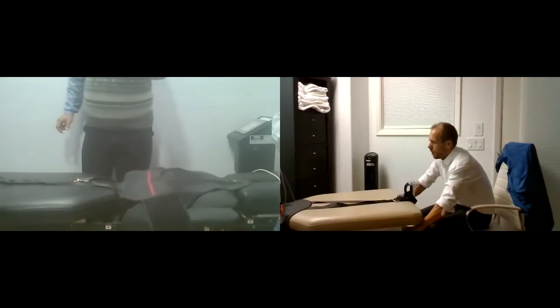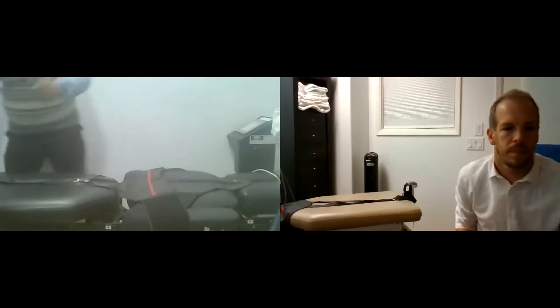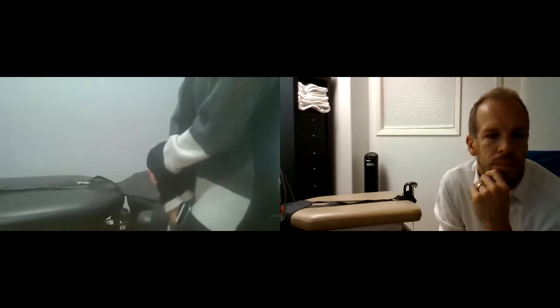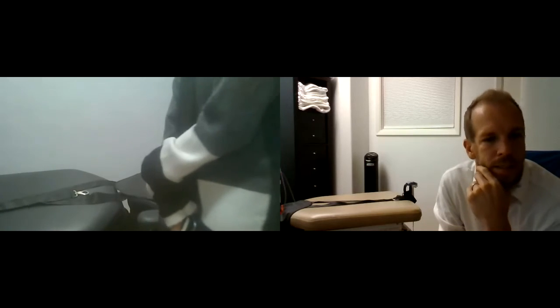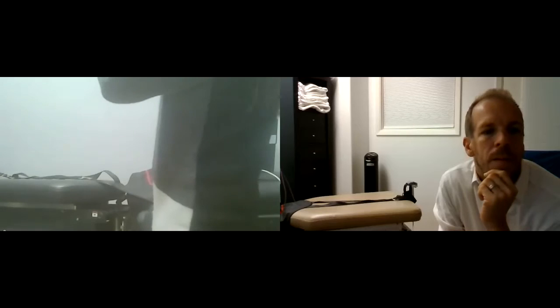Mr. Brian, just hold on. Hello. Just hold on. We'll do it in front of you. Is it like that? Correct. Is it okay?